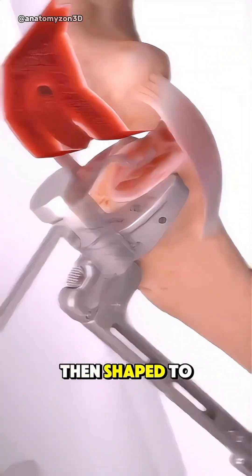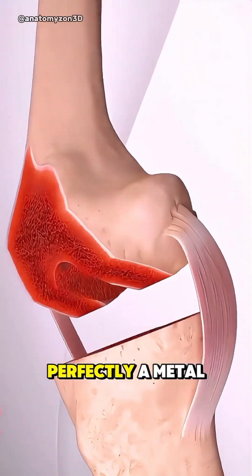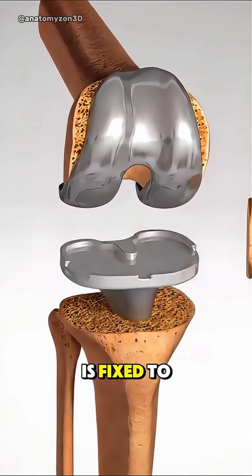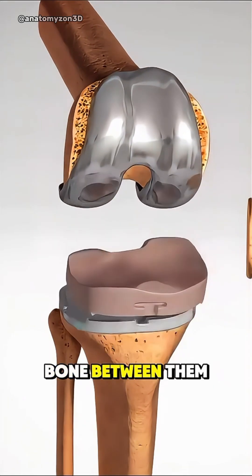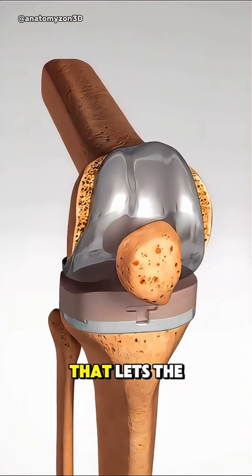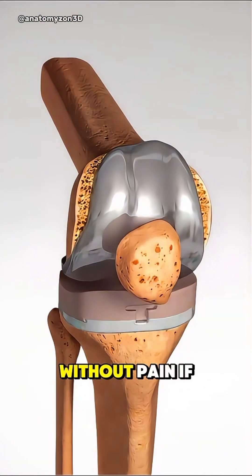These areas are then shaped to fit the new implants perfectly. A metal component is attached to the end of the thigh bone and another metal piece is fixed to the top of the shin bone. Between them, a smooth plastic spacer is inserted to create a gliding surface that lets the knee bend naturally without pain.